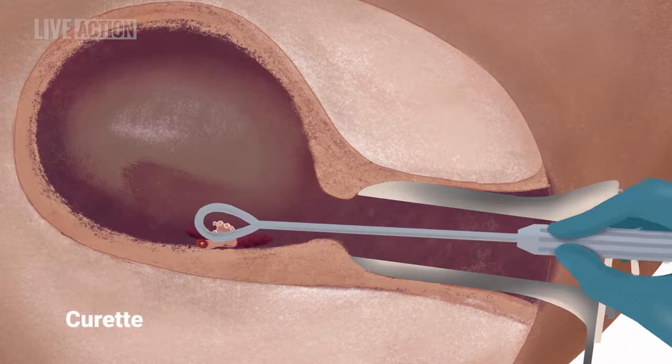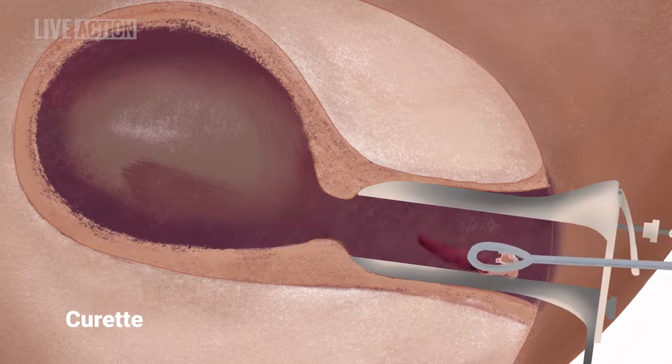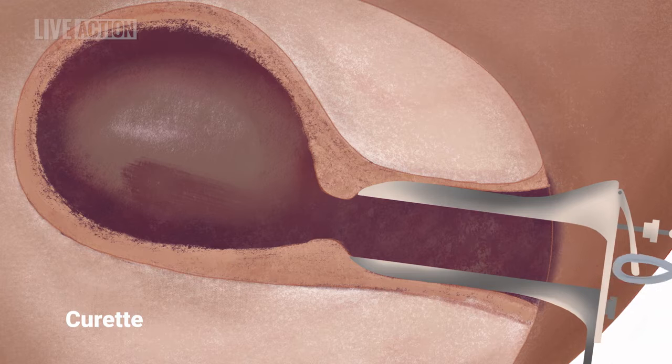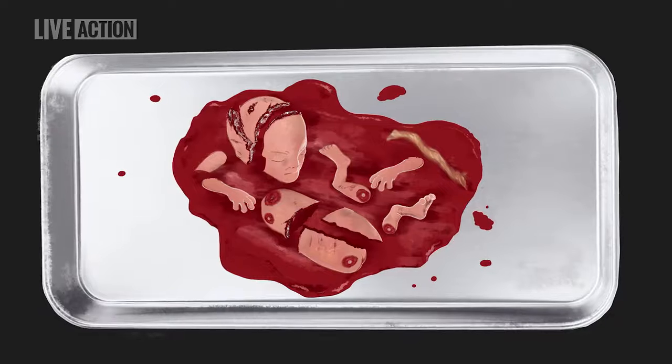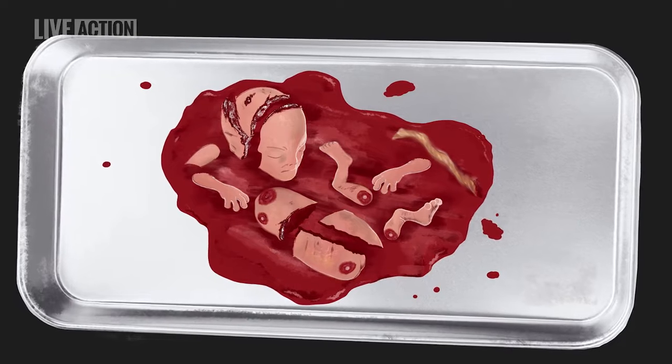Occasionally, the abortionist must remove the cannula and pull out body parts that have clogged the opening to complete the abortion. Once the abortionist thinks everything has been removed, she will sometimes use a long metal curette to scrape the lining of the uterus to make sure no parts are left behind. An incomplete abortion can cause infection or bleeding. Once the uterus is empty and the bleeding is under control and all the instruments are removed, the abortion is considered complete. But before the patient leaves, the tissue must be examined to make sure the placenta and all the body parts are accounted for. Two arms, two legs, a spine, a skull.